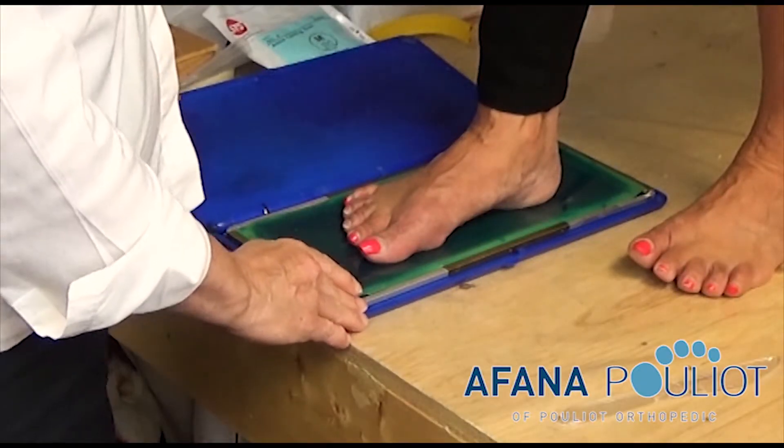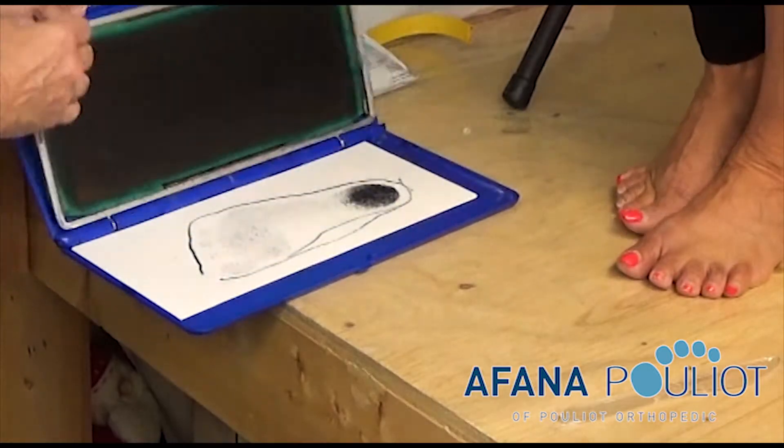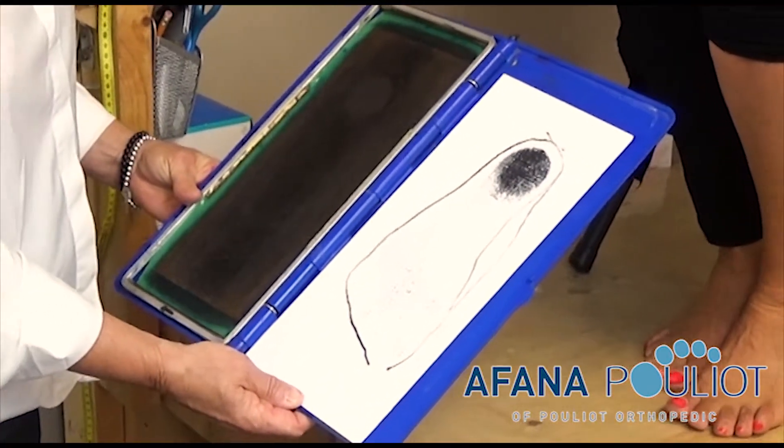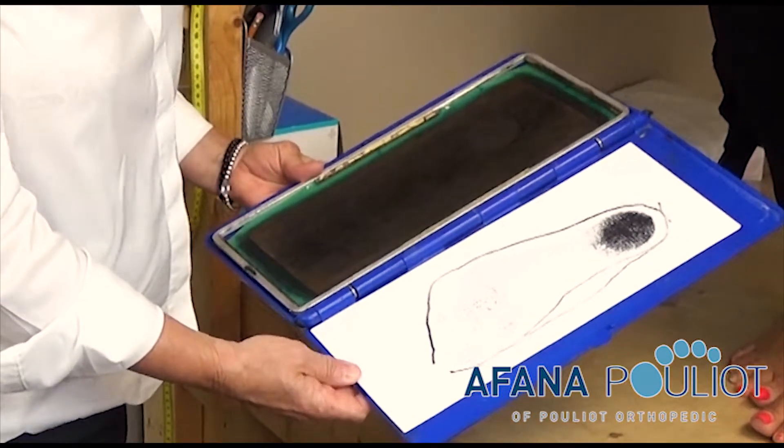Once this is done, you ask the patient to lift his foot, and this is the type of print that you get — one for each foot on a separate piece of paper.